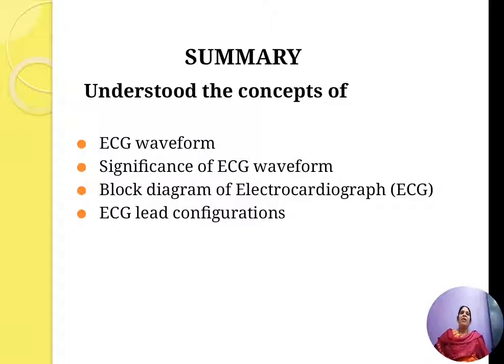The electrocardiogram reflects the rhythmic electrical depolarization and repolarization of the myocardium associated with the contraction of the atria and ventricles. So the shape, interval and amplitude of the ECG give the details of the state of the heart. Any form of arrhythmia, that is disturbances in the heart rhythm, can easily be identified. And the most important part is the QRS complex.